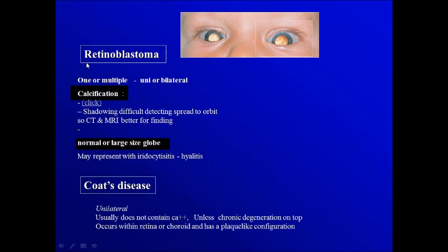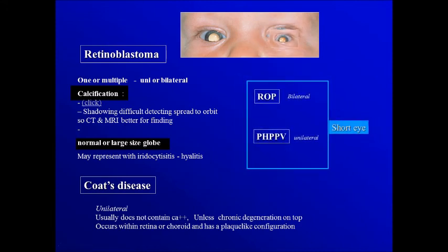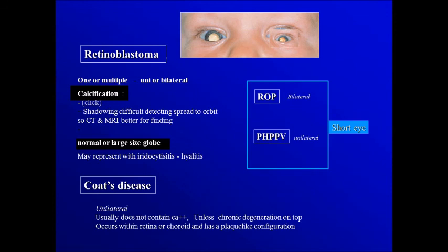Another important characteristic of retinoblastoma is that the eye globe is of normal or large size. This is important to differentiate it from other conditions that produce a similar lesion occurring in short eyes: retinopathy of prematurity and persistent hyperplastic primary vitreous. Retinopathy of prematurity is commonly bilateral, while persistent hyperplastic primary vitreous is unilateral.